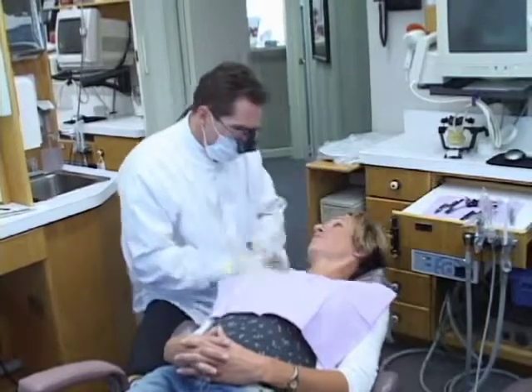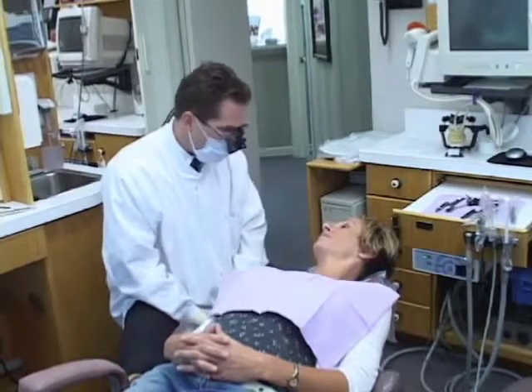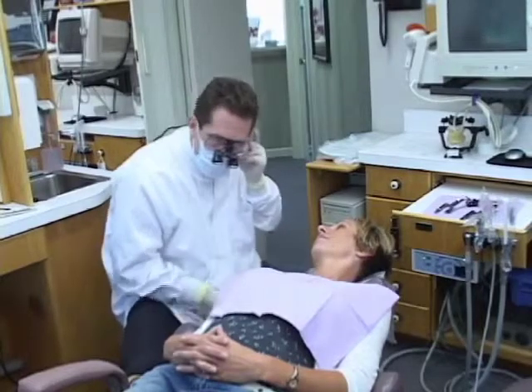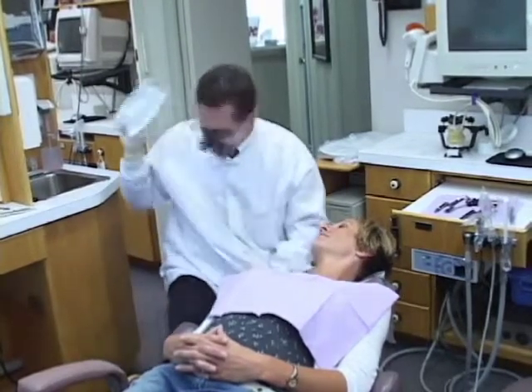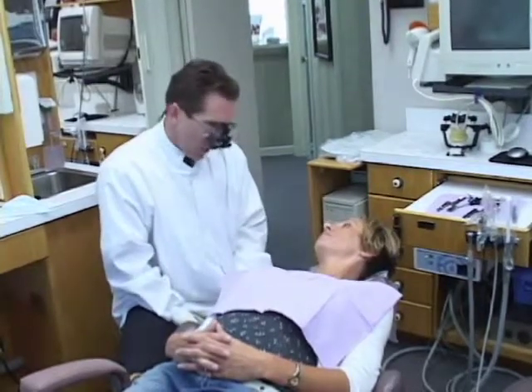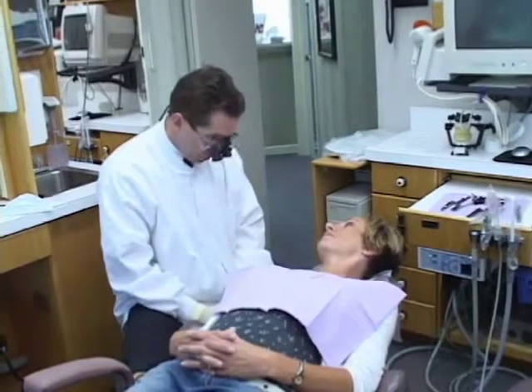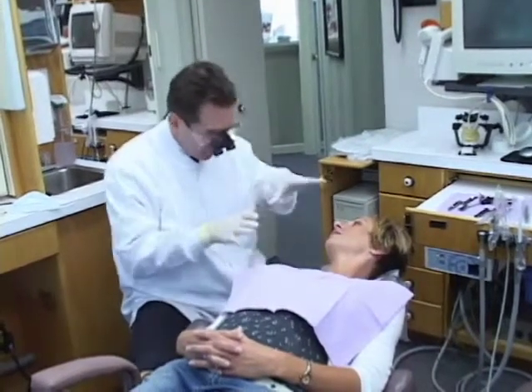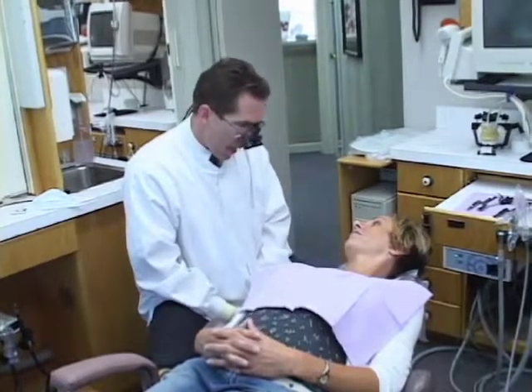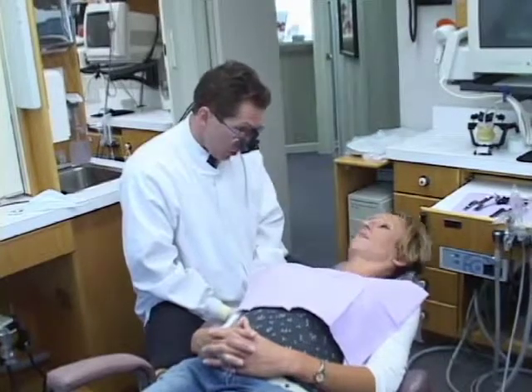So what we'll do, Debbie — we'll have you wear this for the next couple of weeks. I'd like you to wear it as close as possible to 24 hours a day, other than when you're eating. During this time, we'd really like you to be very, very comfortable. You should have no problems — it should feel very comfortable. If anything, it should feel more comfortable now that you actually have another tooth in contact. You have a little more mechanical stability. If you're fine, we'll see you back in about two weeks, and we'll do on you what we just described on the models.